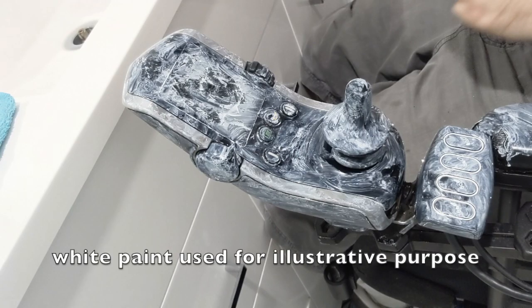How to clean a power wheelchair controller. Note: white paint used for illustrative purpose.